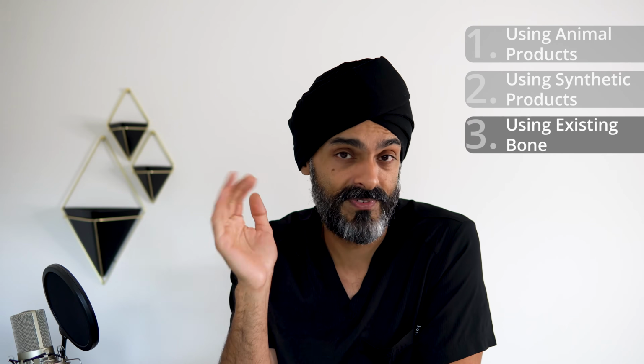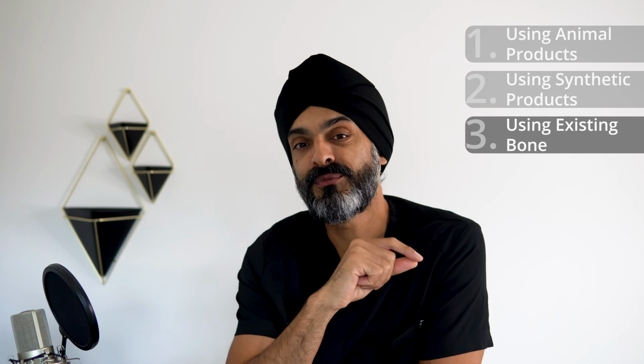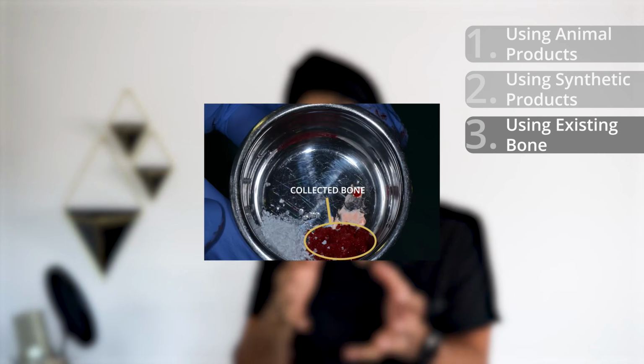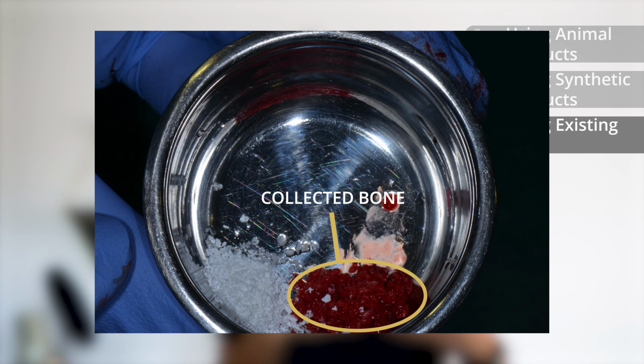And there's a number of techniques. One technique is one that I use very commonly, and it almost is like I'm using a shaver on the bone. Okay, and don't switch off just yet. Let me explain. What we do is, if we can shave little bits of bone from the back, and it sounds horrible, okay, I appreciate that. What we end up with is almost that bone sandy product, which I mentioned earlier, which we get from animals. We get that, but it's all your own stuff. It's got your blood vessels. It's a live bone. And we put it in a pot, and then we move it to where we want the new bone to develop.